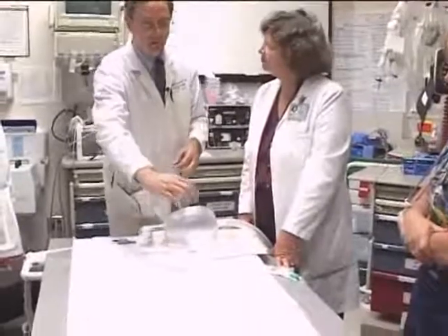Now we go ahead and actually intubate the patient. Usually the first move is with a laryngoscope to look in there, followed by a suction because there's always some types of secretions that are back there, then followed by attempts with a manual oral tracheal intubation. Once the tube passes in there, the person that's holding the cricoid pressure does not release the cricoid pressure until we know we're in the right spot and we have the balloon out.